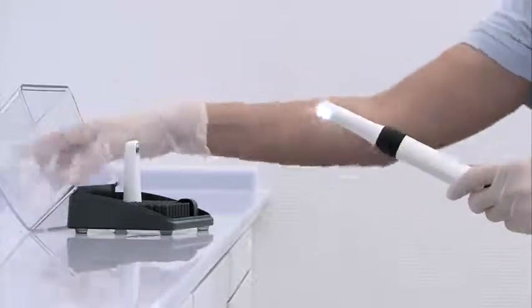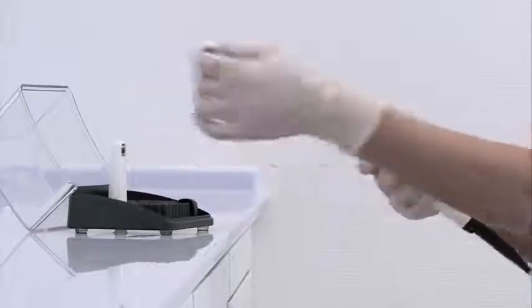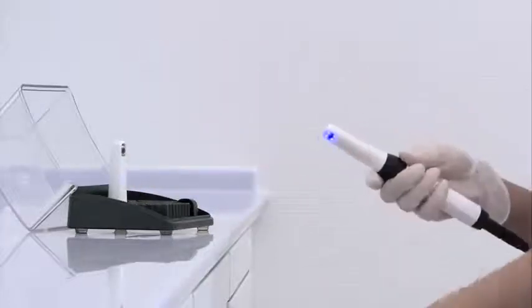Thanks to the practical and unique interchangeable head idea, the Vistacam iX provides intraoral images and at the same time allows for a genuine caries diagnosis.